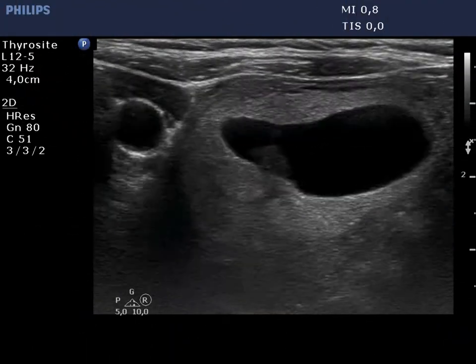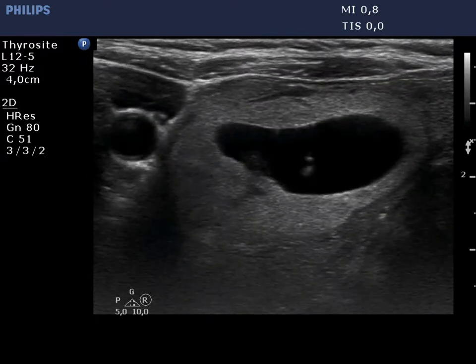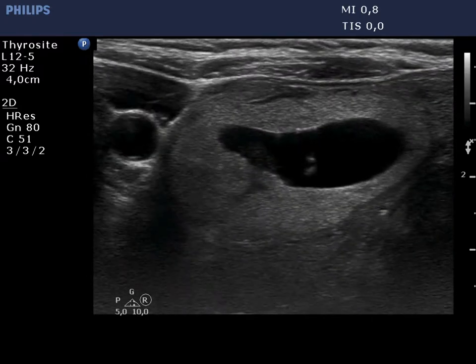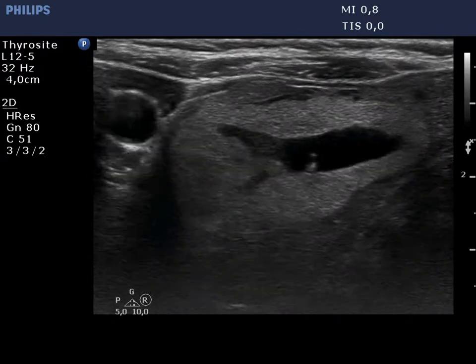Now we perform ultrasound-guided aspiration and have removed 4 mL of serous fluid.